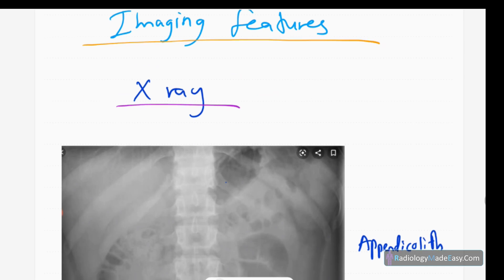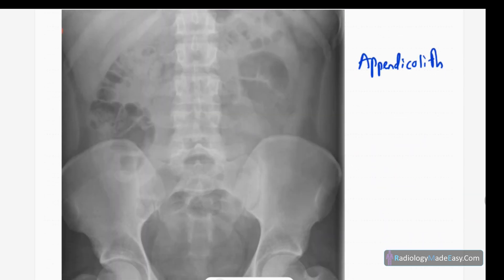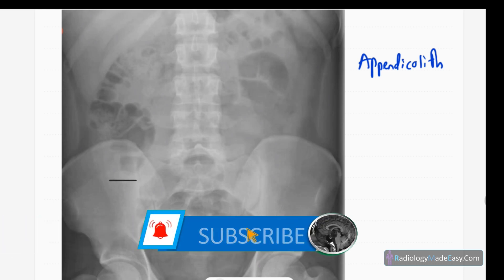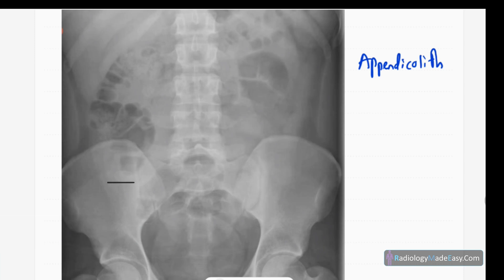Now let's start with X-ray features. This is a frontal radiograph of the abdomen. In the RIF region, you can see a rounded opacity — actually two rounded opacities — called appendicoliths. This patient presented with RIF pain, so we have to suspect obstruction of the appendix due to appendicoliths. There are no complicating features like pneumoperitoneum or bowel obstruction.